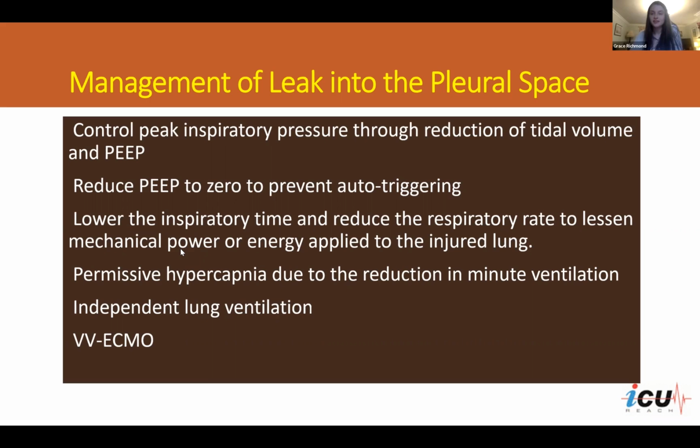Lovely, thank you for answering that question. Next question: is there any role for high frequency oscillatory ventilation in management of patients with bronchopleural fistulas?